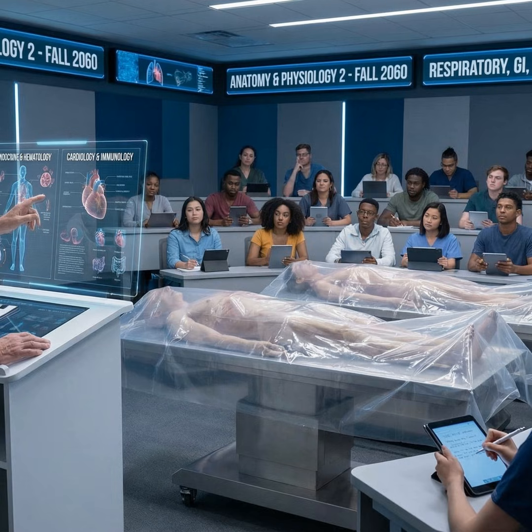The next step, especially for your exam, is to know the most common causes for each of those patterns. You need to know your list of suspects. For obstructive diseases, this is probably one of the highest yield mnemonics you can learn. Just remember, CBABE: cystic fibrosis, chronic bronchitis, asthma, bronchiectasis, and emphysema. If you see that scooped-out loop, one of these 5 is almost always going to be your answer.